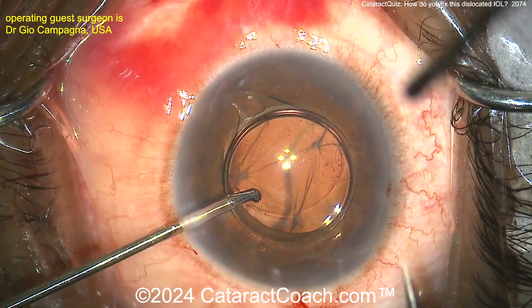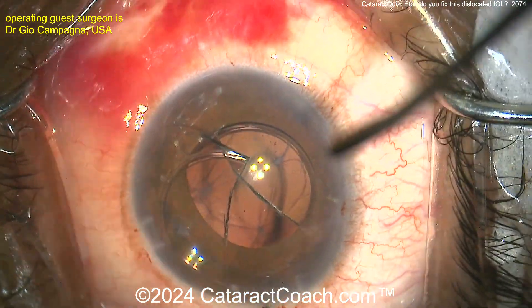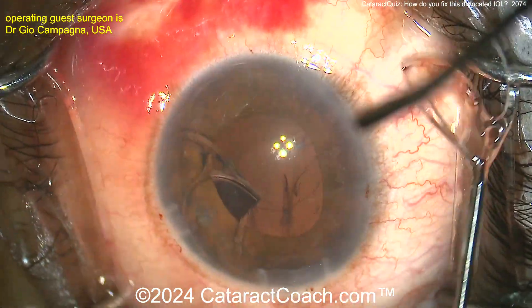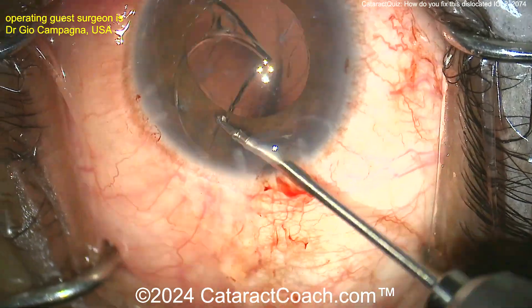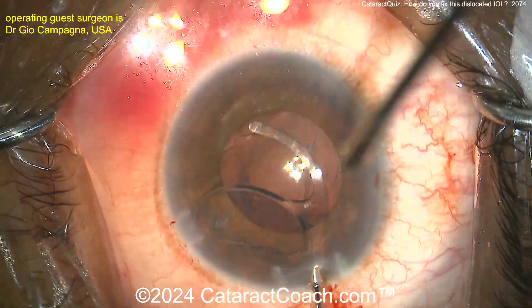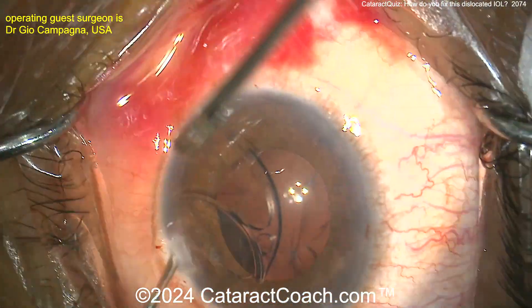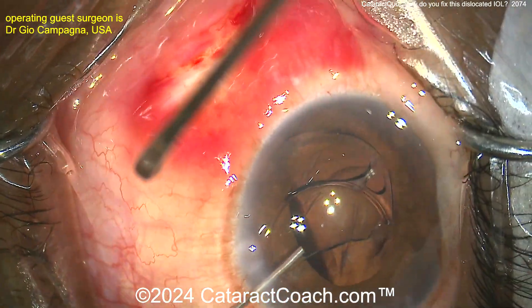The surgeon's going to cut this one out, so there goes that lens. Perhaps there was also some sort of refractive error that you could address by an IOL exchange. There comes the lens. You could have used our twist-it-out technique — but okay, you cut it in half, I get it. With twist-it-out, you'd already be done by the way, and you'd have the lens intact.